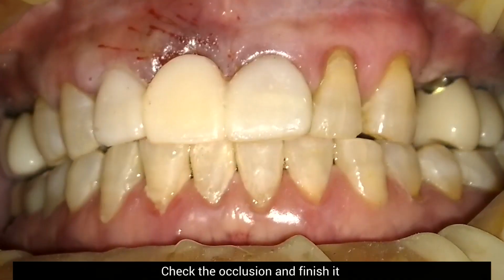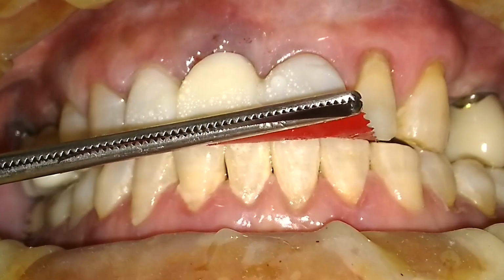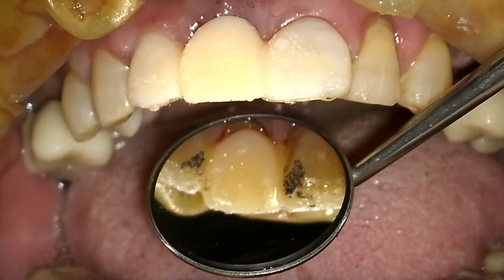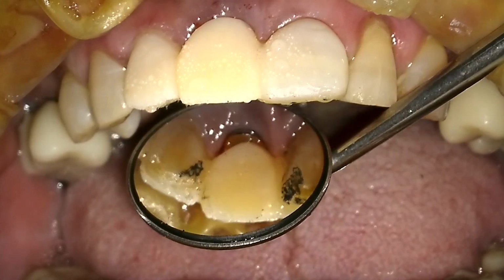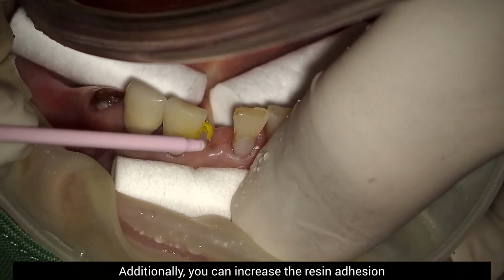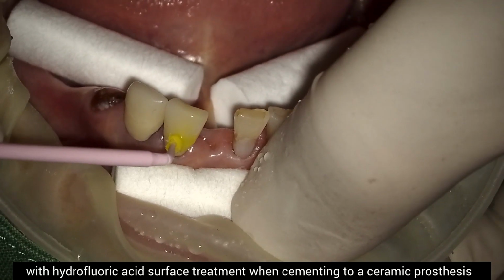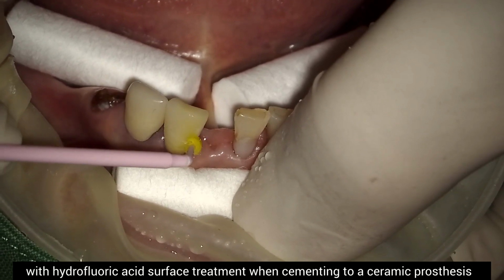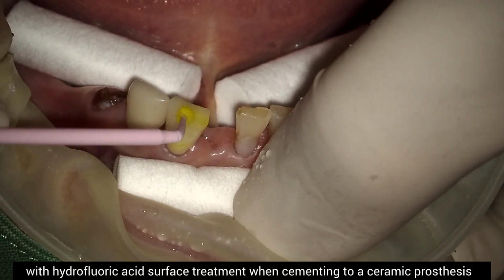Check the occlusion and finish it. Additionally, you can increase the resin adhesion with hydrofluoric acid surface treatment when cementing to a ceramic prosthesis.